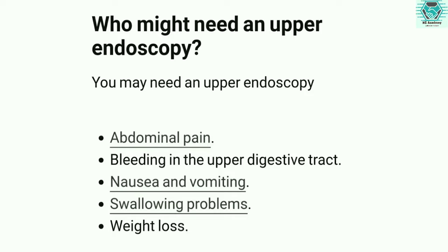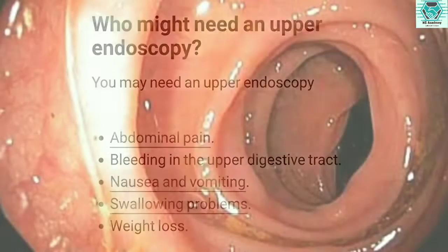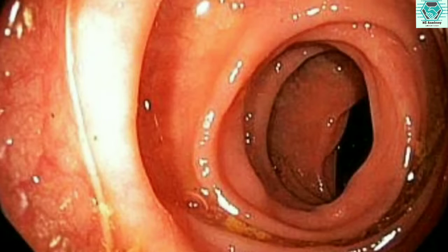So after reviewing a patient's variety of symptoms, the doctor goes for the endoscopy so that the ultimate diagnosis can be done.